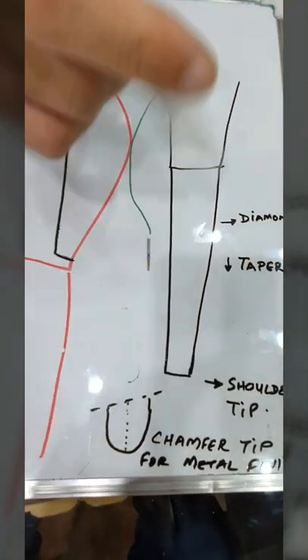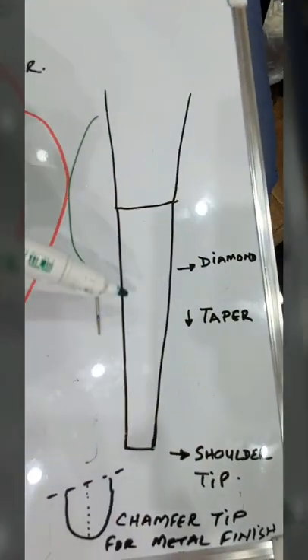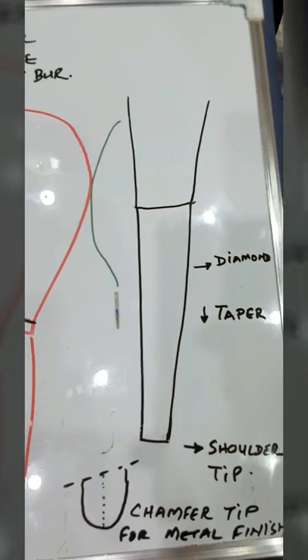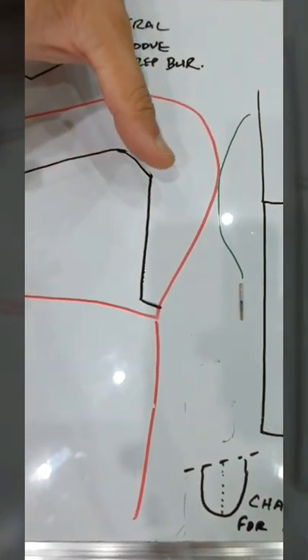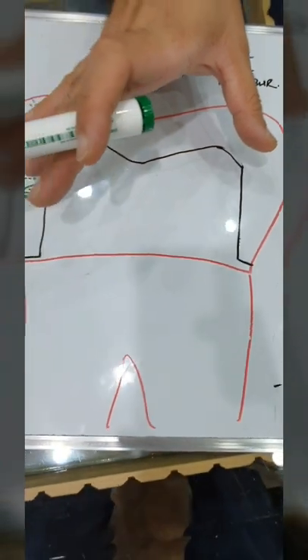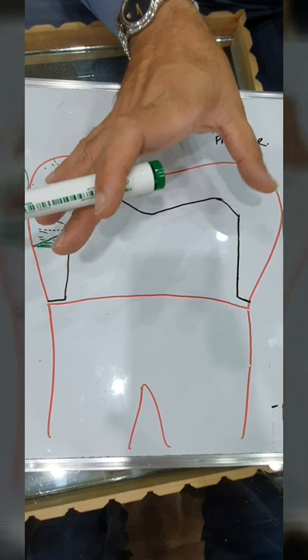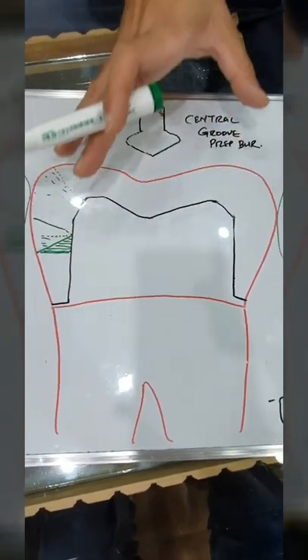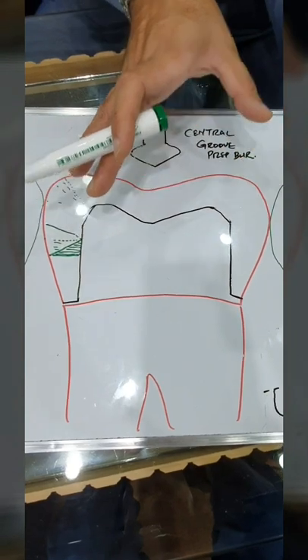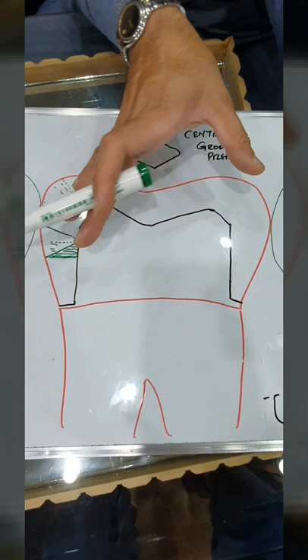Having said that, we come back to the diamond. The diamond itself would have taper, and this is the built-in taper that you do need for retention. If these two walls have undercuts, of course you would not be able to seat the crown down, but if they are convergent by a few degrees, 6 to 12 degrees, then you have good resistance to dislodging. Good retention would be built into the crown prep.